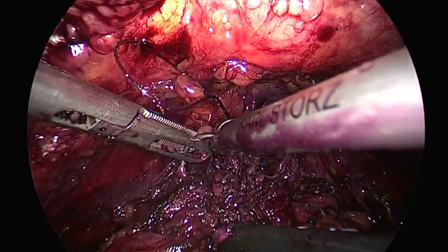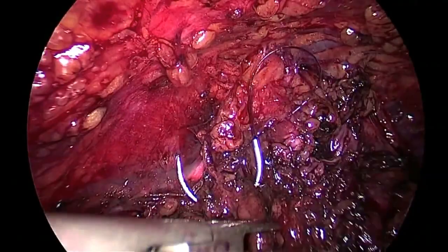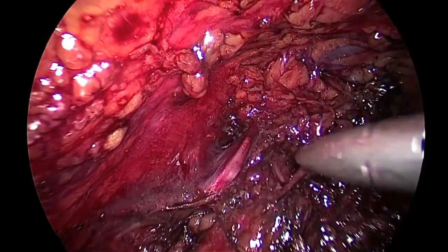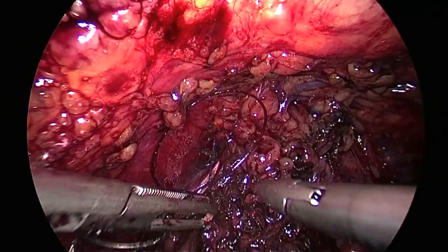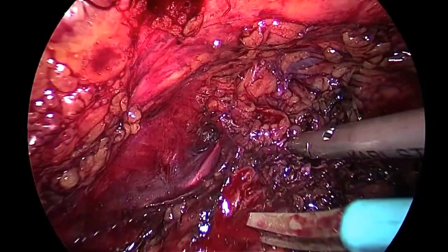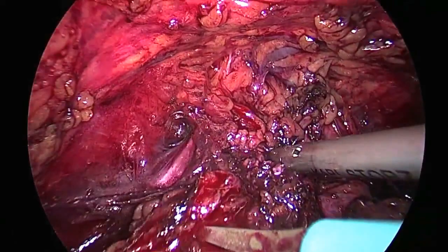Francesco, tell me. For learning radical prostatectomy, you think this is the good way? I think that laparoscopy is dead for radical prostatectomy. As you know, we showed in the past, in a randomized study published in European Urology, that there is a difference not in terms of blood loss, but in terms of functional results. Now we are analyzing the results of this series of patients after 5 years, and in the next days we will send this paper to European Urology. We show after a minimum of 5 years of follow-up that the results are better for radical prostatectomy with a robotic approach.